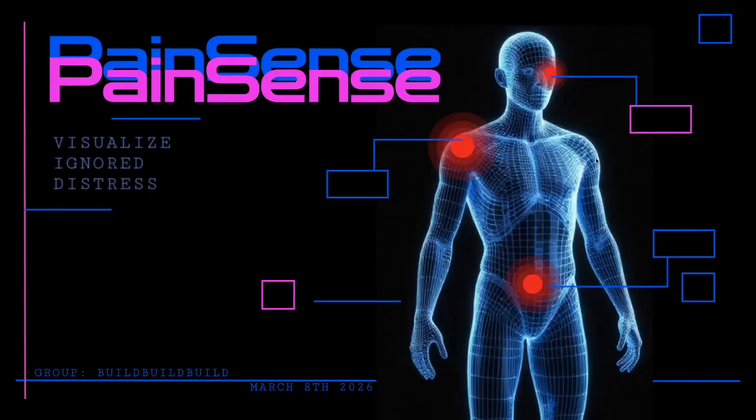So overall, PainSense imagines a future where internal body signals are no longer invisible. By combining biosensing technology with intuitive visualization, PainSense helps transform pain into a shared language between patients and clinicians, improving communication, understanding, and care.